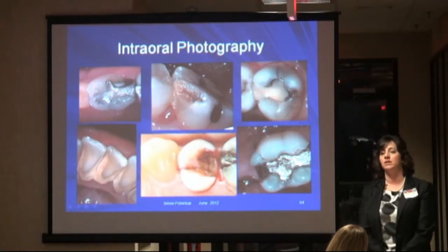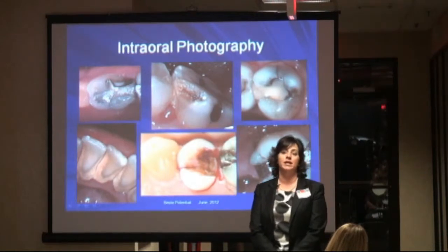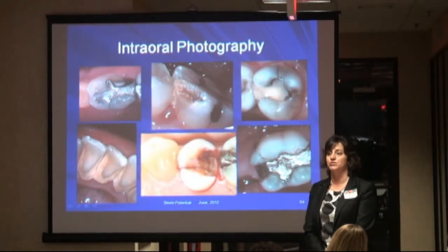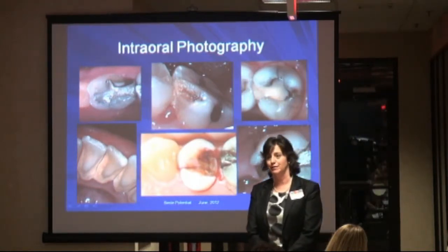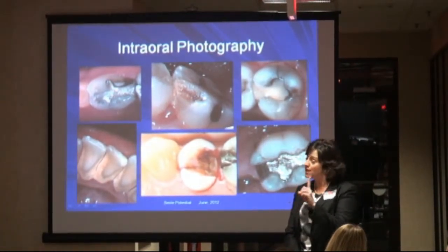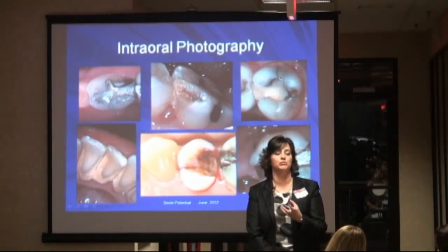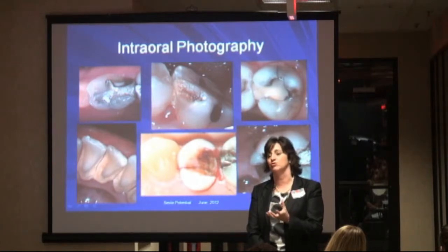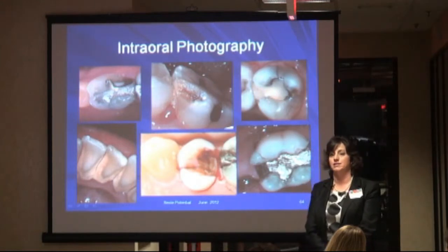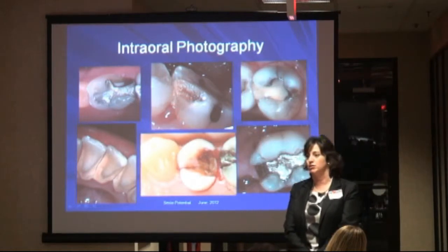So use the intraoral camera as frequently as possible, and we like to say it's a tour of the mouth. In a hygiene situation during an exam, it's a great thing to take a series of photos. You always want to take a picture of something pretty, like that little smiling tooth that we had up on the screen a couple minutes ago. Almost every person on this planet has at least one beautiful tooth. Take a picture of that first and show them what a healthy-looking tooth looks like. Then show them some things in their mouth that are not pretty and not healthy, and demonstrate to them that we can restore them and get them back to a place of good health and to their original state.